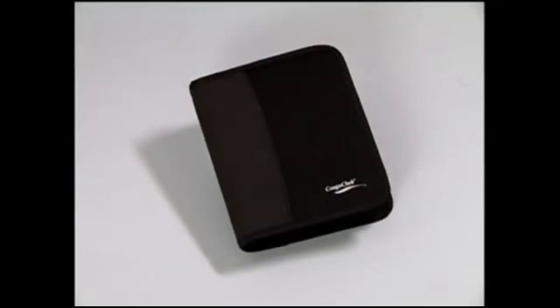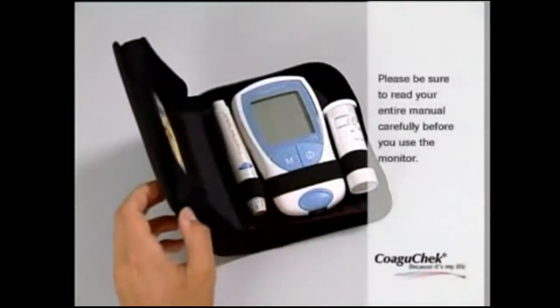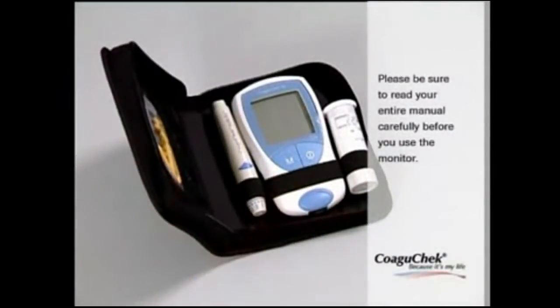The Coagucheck XS system offers a simple, convenient and safe way of INR self-monitoring. This video guide will show you how to use the monitor properly. Please be sure to read your entire manual carefully before you use the monitor.